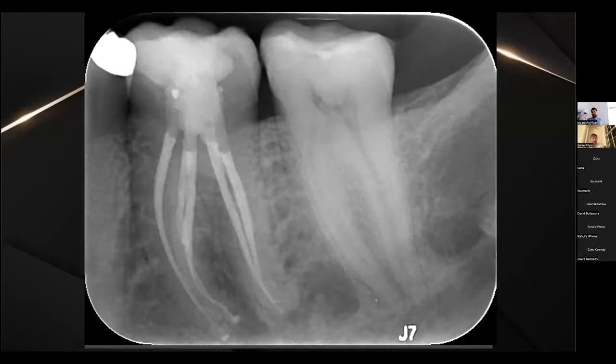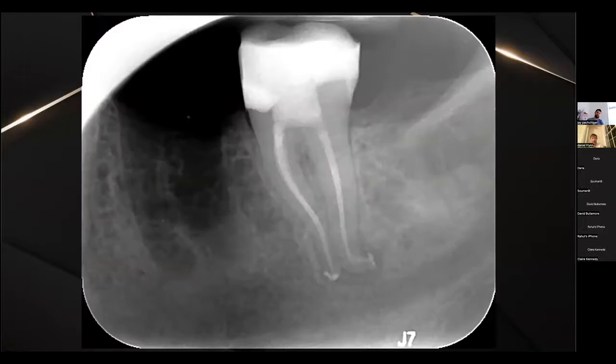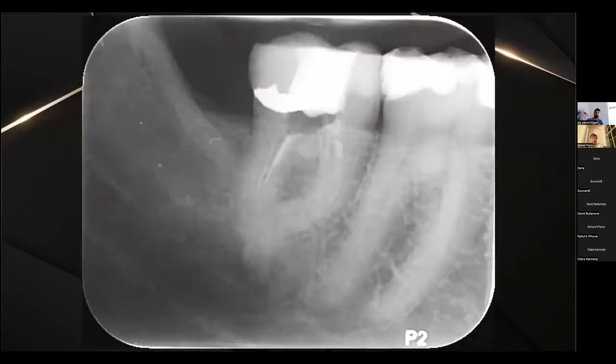And again, if you're trying to get your resin-based sealer in by coating that GP cone, it's unlikely you're really getting much sealer into those apical areas at all. So that bioceramic obturation in these types of canals really, really does make your life a lot easier. This was the 3 and 7 over here. The 6 was actually taken out before I could have a go. Again, where we've got an S-shaped curve, a lazy curve on that distal, that bioceramic obturation is much, much easier compared to what we used to try and get done.